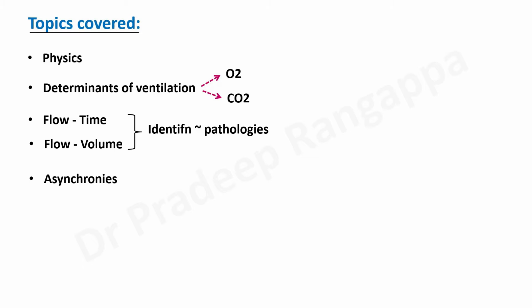The reason we have to talk about asynchronies is that even the latest advances happening in ventilation dwell upon rectifying or mitigating the asynchronies, because the artificial intelligence being incorporated into ventilators is primarily identifying significant asynchronies that prevail between the machine and the patient. Correcting this will enormously improve the ventilation. So with that in mind, asynchronies become important for us to recognize.